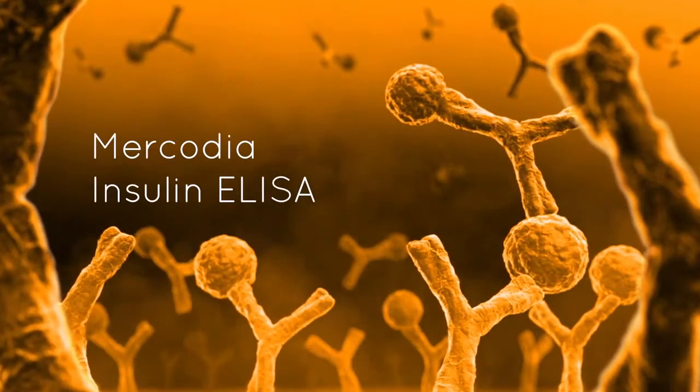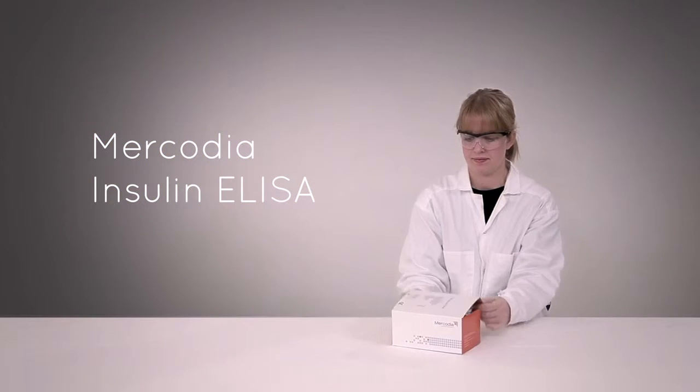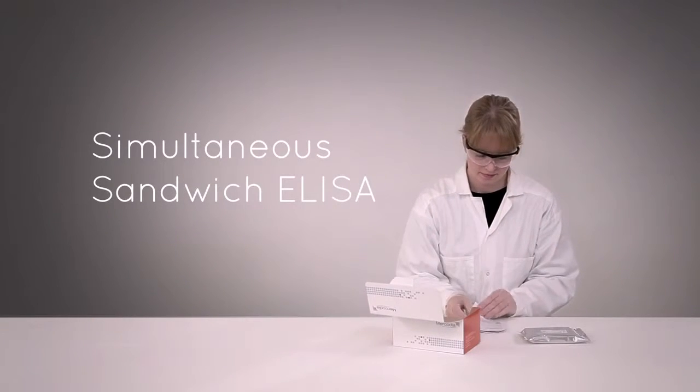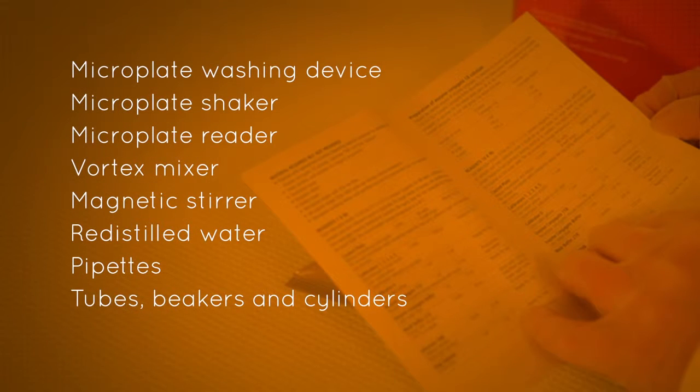This video will guide you through the procedure of running a Mercodia Insulin ELISA. The assay is designed as a simultaneous sandwich ELISA. Before you get started, please review the directions for use to become familiar with the specific kit instructions. Make sure you have all necessary equipment listed and in good working condition.